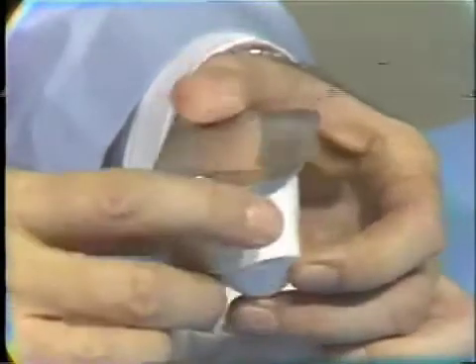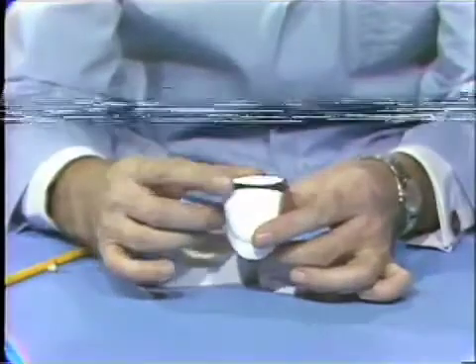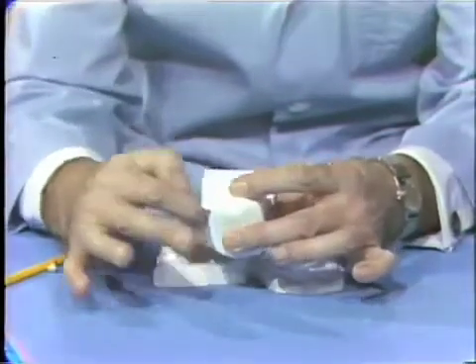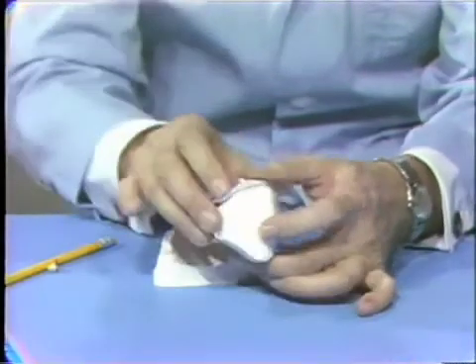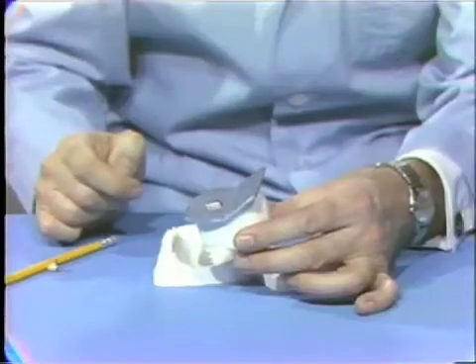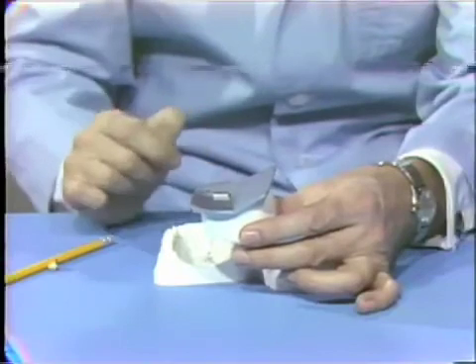And then when that is completed, we polish all those cut surfaces and go back to trim the backing to the correct size for the particular facing that we're using, and then wax onto that the occlusal surface which goes on here. So those, in brief resume, are the several stages that we'll go through in adapting this facing.